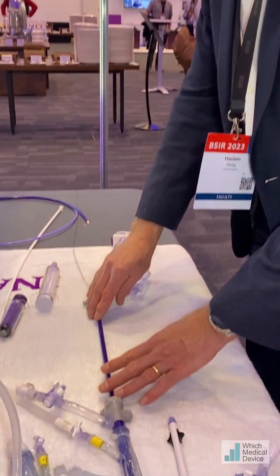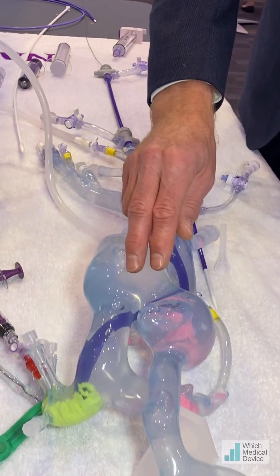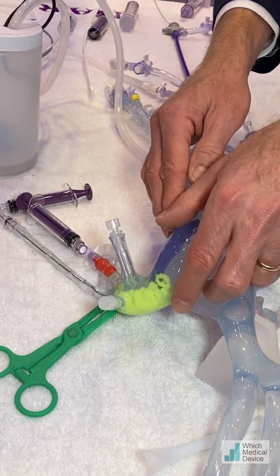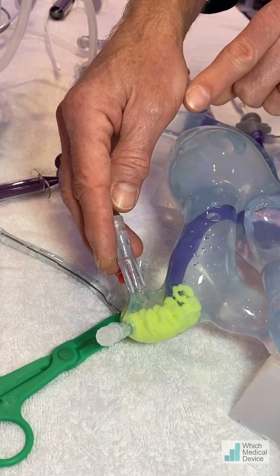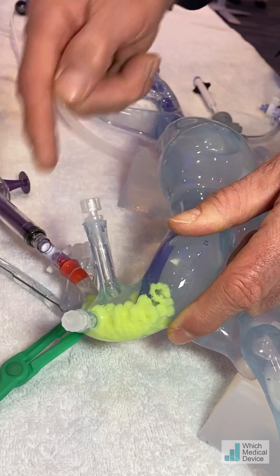Along with help from Andy Slade here from Inari, I'd like to demonstrate exactly how this works. This is a 24 French device. We've got it coming all the way up the IVC, through into the heart, through into the right — sorry, left main pulmonary artery — where we've got a nice clump of yellow thrombus.